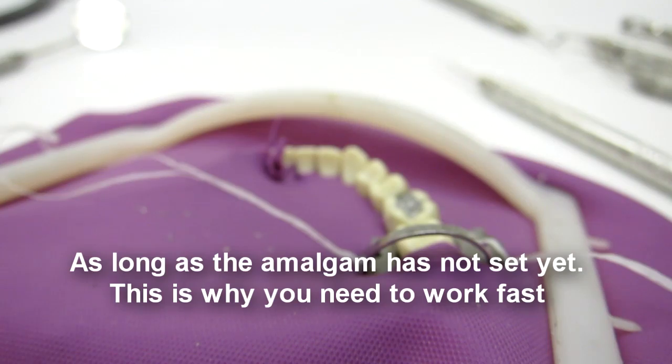If your marginal ridge breaks, don't panic — get another capsule, condense it again.